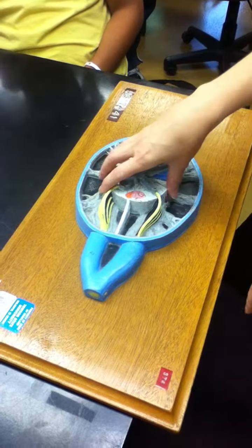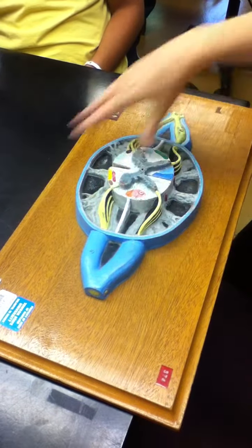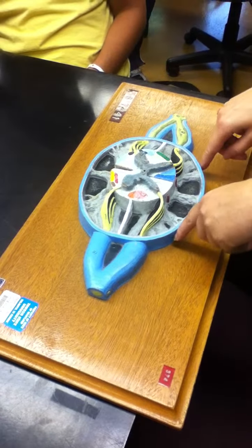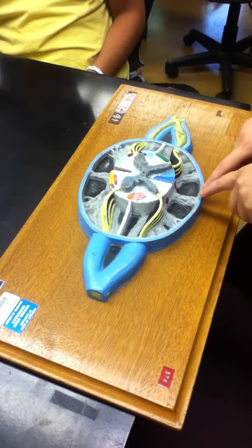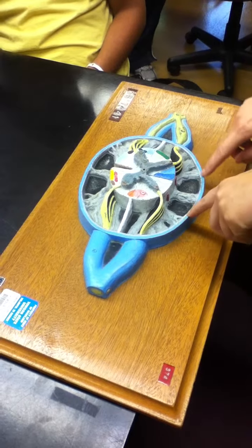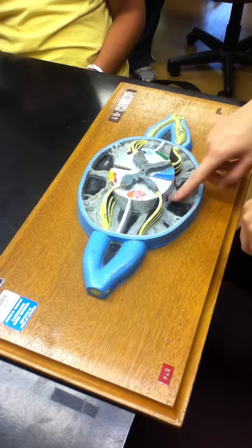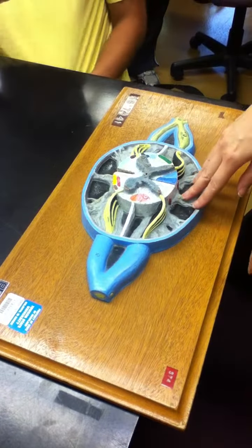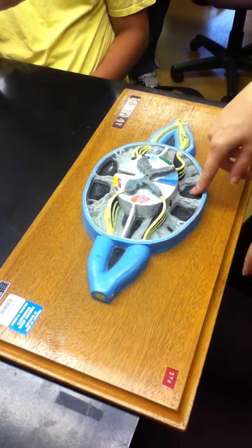Spinal cord, which we've seen in lecture. The meninges are all around it. The outer blue layer is the dura mater. So the big thick layer is the dura mater. The thin gray line underneath it is the arachnoid. And then this sort of gray where it looks a little bit webby, sort of gray and black, that's the subarachnoid space, and cerebrospinal fluid is in there.